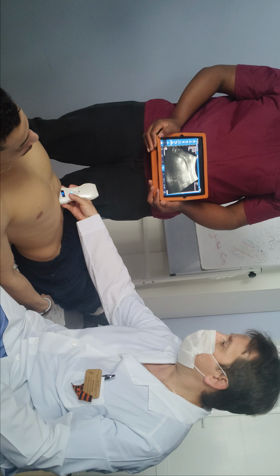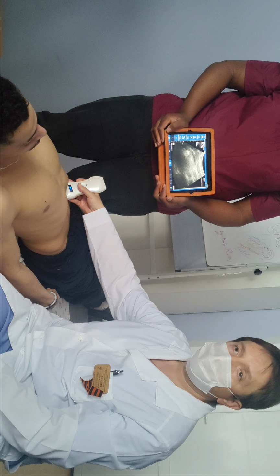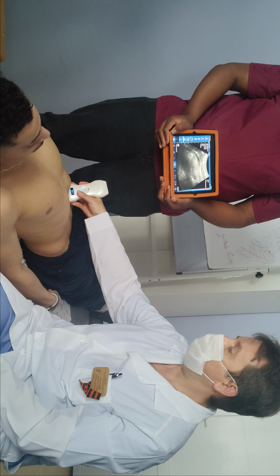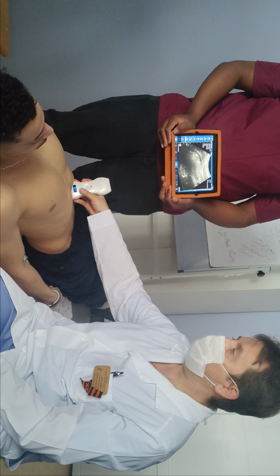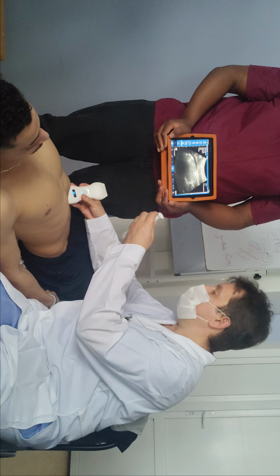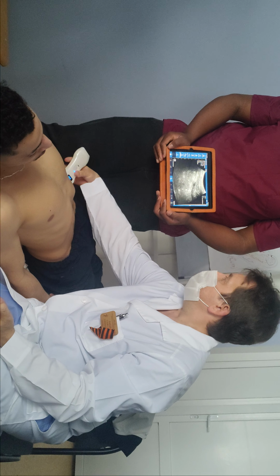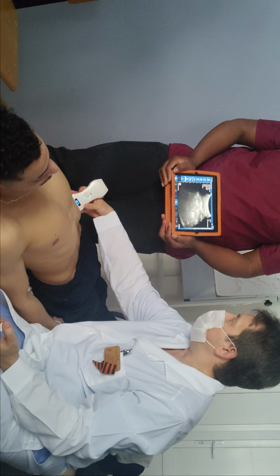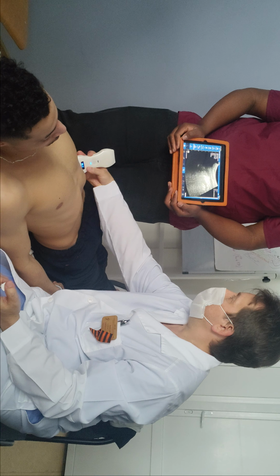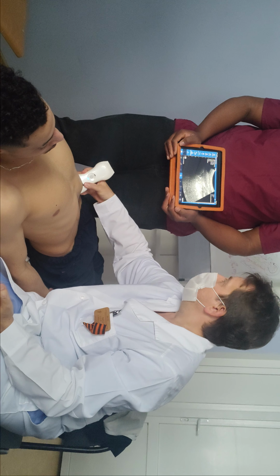In some cases you may shift position and go to the opposite side because it may be easier for you. But usually you will do it from one point, and if you are qualified it takes no more than 5 minutes. Just for understanding whether you have damage. So it's a very valuable mechanism. For that, you must find either 3 parts, or at least 2 parts of internal organs.